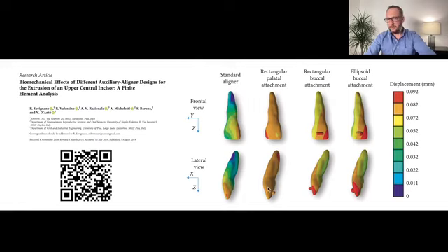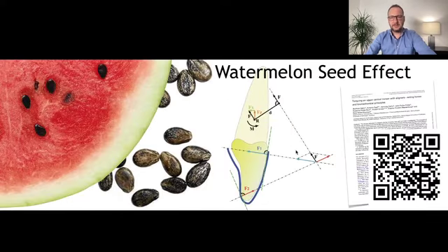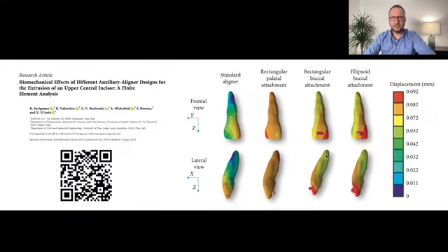I know this is very good for the patient, okay, but for us it's more difficult to place, and depending on the case, it's not as effective as placing on the buccal surface, okay? But this study showed us that the result, as we can see here, the displacement, is the best one, of course, where we have more movements, placing on the buccal side, okay?